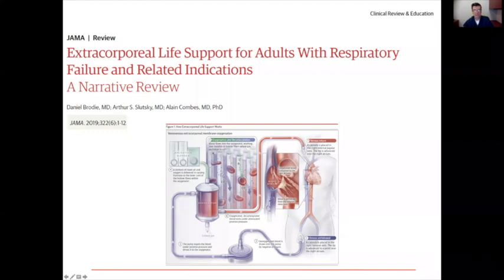But you can see there are these mats of hollow fibers. This is inside the oxygenator. They're like straws, and the gas goes through the straws and blood washes over them. And in doing that, they exchange gas just like you would in the alveolus of a lung by diffusion of gases, the oxygen out of the membrane, out of the fibers into the blood, and the carbon dioxide from the blood into those fibers. And then the carbon dioxide is released in the exhaust gas from the oxygenator.